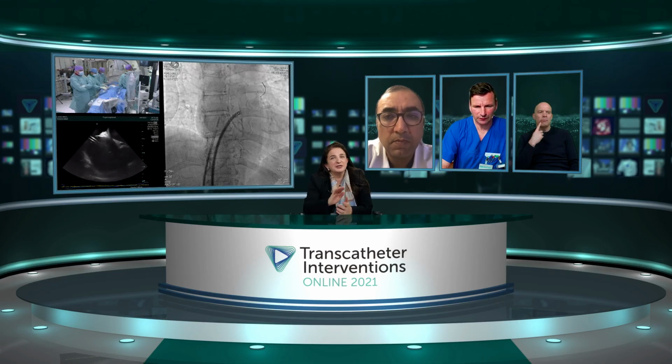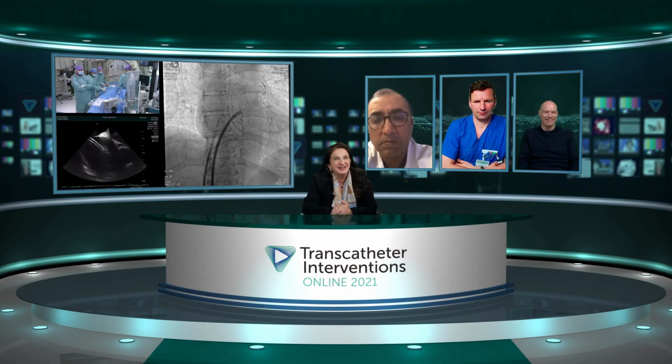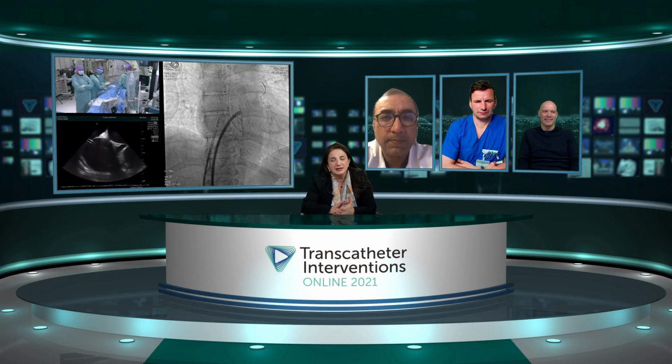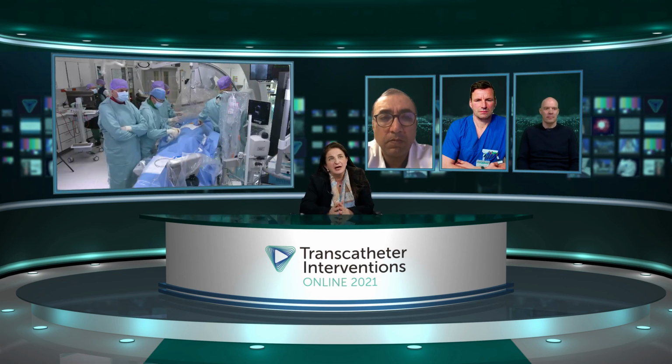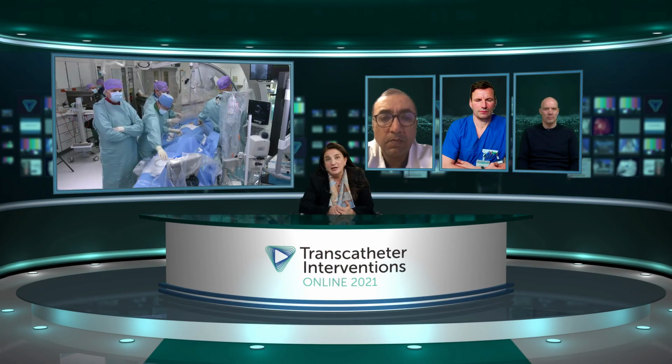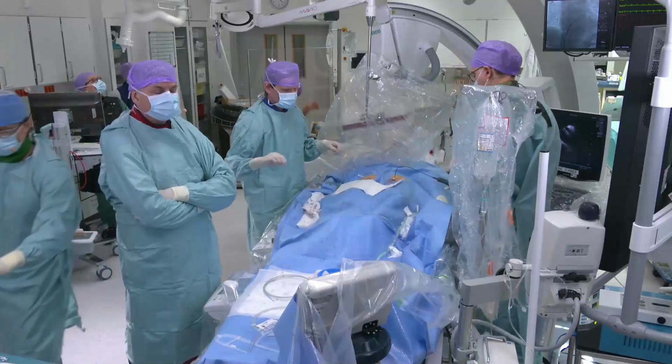Hi, Roxana. I just wanted to take a quick pause because I want to introduce our new panelist, the director of the courses on here, and we have a great panel. We have Nicholas Van Meegen, Holger Thiel, and Azeem Latib, all three experts in left atrial appendage closures, and this was a beautiful demonstration of the use of ICE. I think what you guys have done, Niels and Ole, very nicely demonstrates the use of ICE.